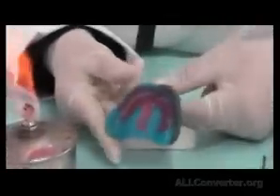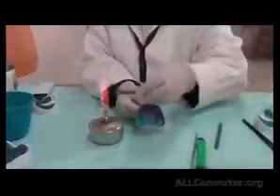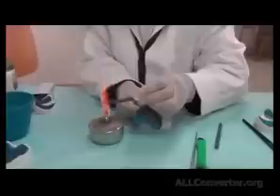So as we were looking in your primary impression, we were looking at the border and concentrating on the border, as you remember. I was asking all students to identify the borders of the sulcus. So here as well, we're looking for this continuous roll of material without a lot of excess on the buccal side and without any excess in the fitting surface area. So we have finished border molding this side. We're ready to do the other side.